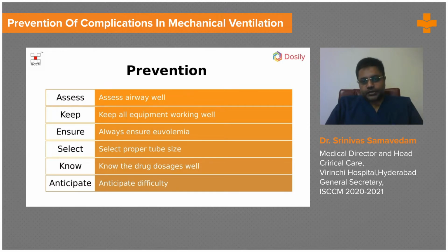Now, the process of extubating a patient or weaning a patient from ventilatory support actually begins at the time of initiating ventilatory support. If you choose an inappropriately small tube for a patient, they will struggle hard to breathe, and you will never be able to match their demand because the tube you chose has put a lot of resistance in the circuit. On the other hand, if you choose a tube that is bigger than what's correct for the patient, you could end up with mechanical complications like stenosis and cord damage, which we discussed before.